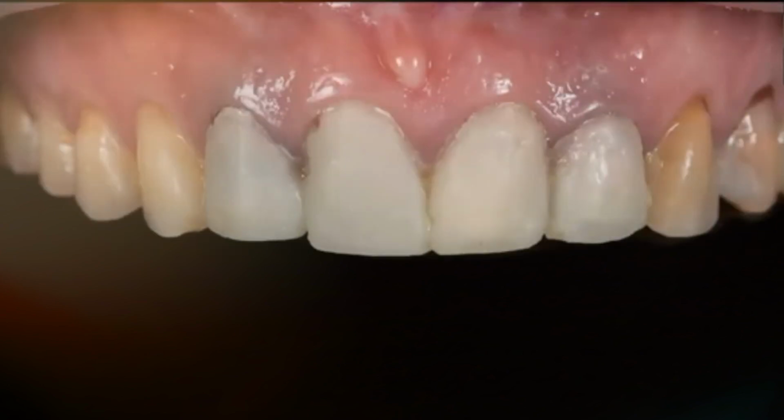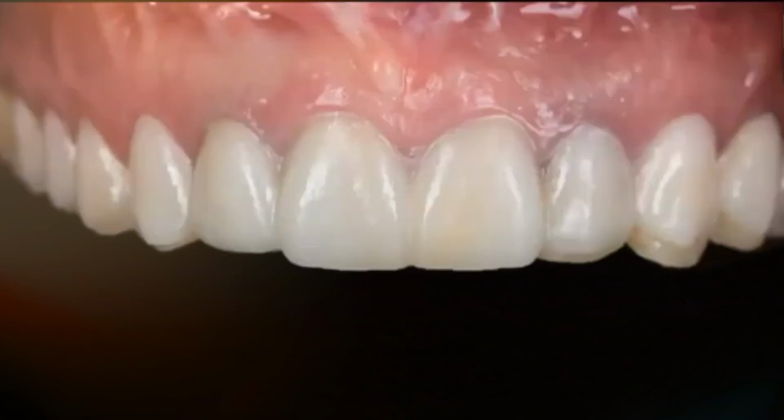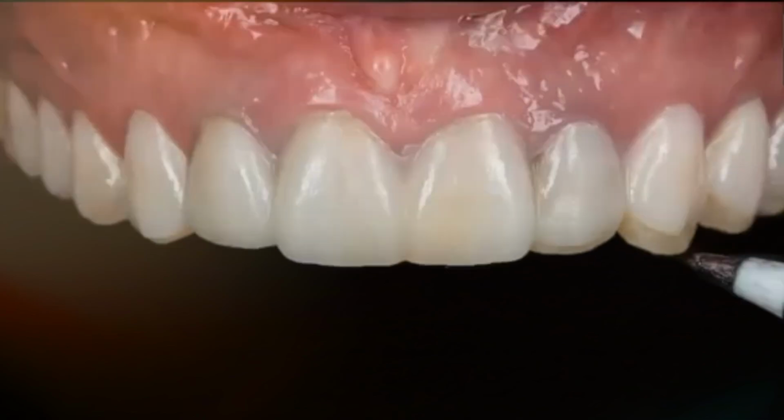Here's an example again where we have dark teeth and dark roots. And like in every case, you do a design first. And to show the patient the modifications of the design, you put the mock-up on top, and then you're going to paint with the black marker the areas that you're going to reduce.